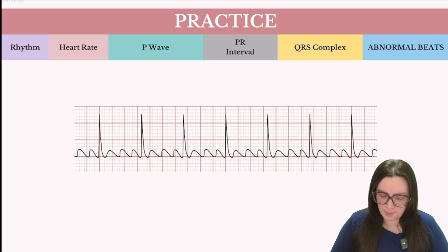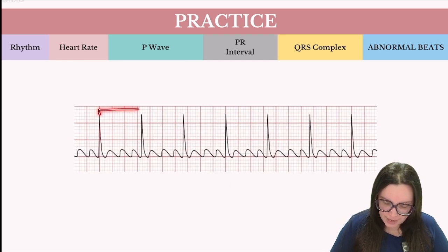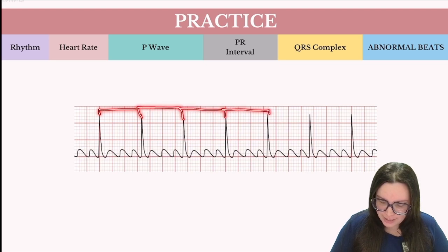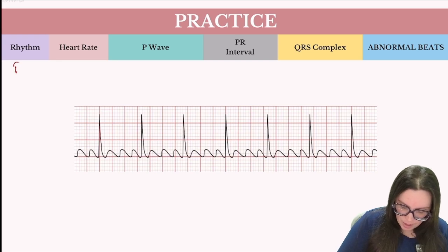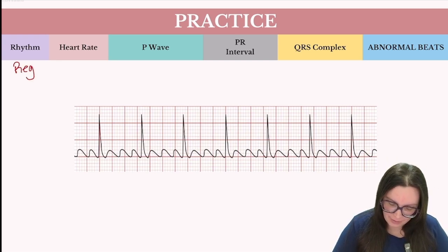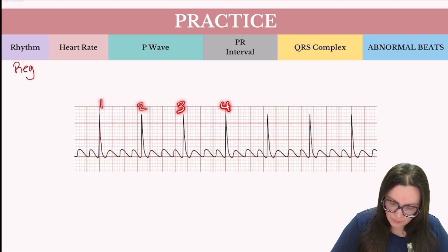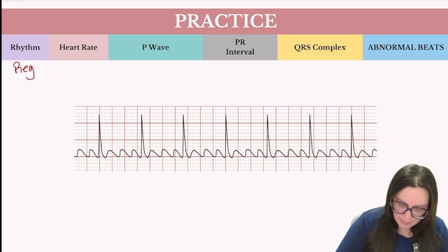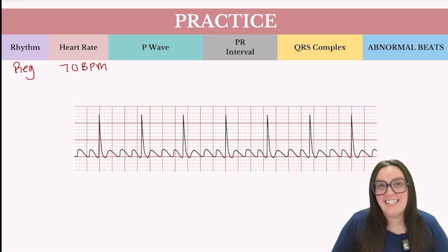Let's take a look at our next practice. Is the rhythm regular or irregular? If I march these out, they're going to fall in the exact same place every single time, so we can call this rhythm regular. When it comes to heart rate, counting out the QRS complexes: 1, 2, 3, 4, 5, 6, 7 — approximately 70 beats per minute.